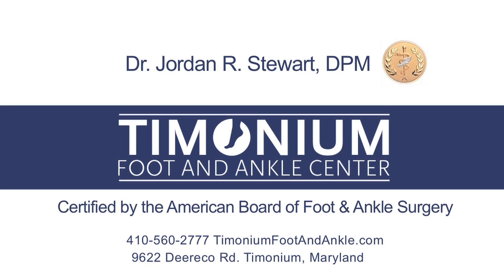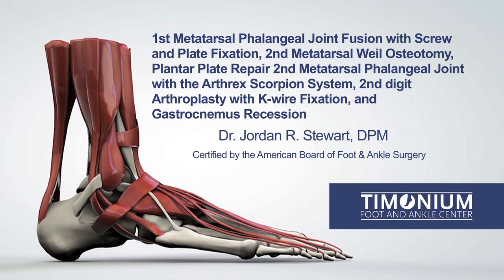This is Dr. Stewart of the Timonium Foot and Ankle Center. What I am about to show you is a corrective surgical procedure to fuse the first metatarsal phalangeal joint, perform a second metatarsal Weil osteotomy, correct a dorsally dislocated toe with the Arthrex Scorpion system, repair a second-digit hammer toe with a K-wire, and perform a gastrocnemius recession.